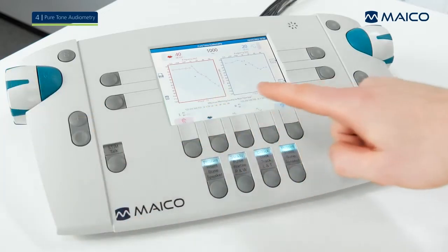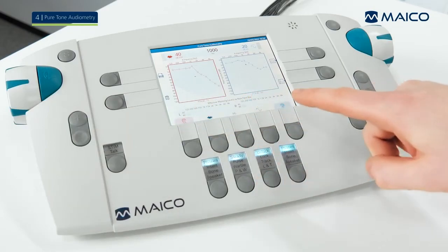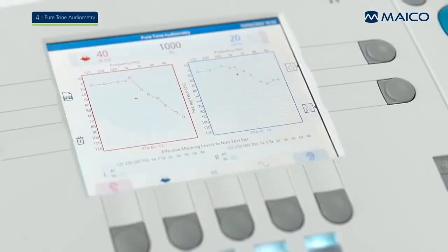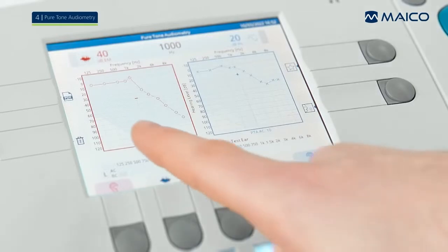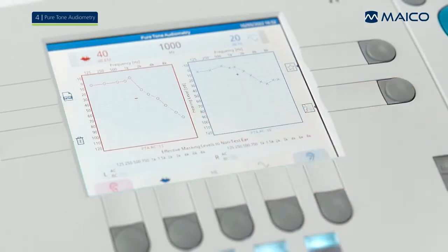Below the audiogram, the calculated PTA values will display, and the masking tables can be displayed when enabled in the settings. The tables show the effective masking levels when masking has been applied. In the 2 audiogram view, the maximum level of the selected transducers is indicated by the gray area.